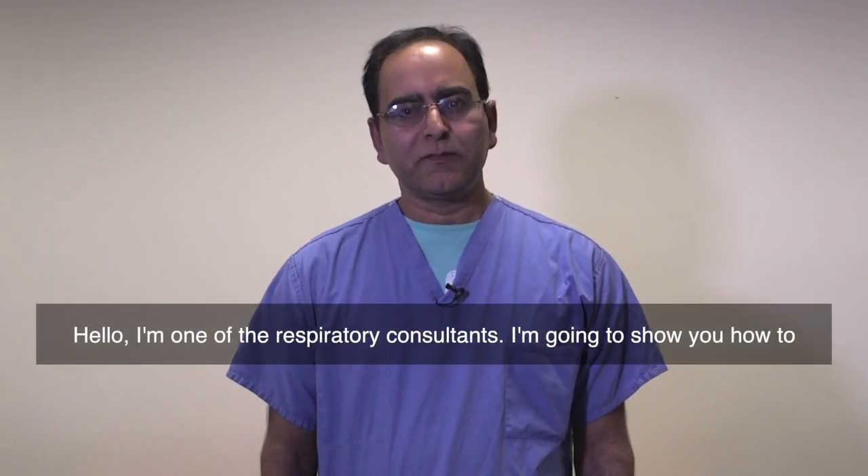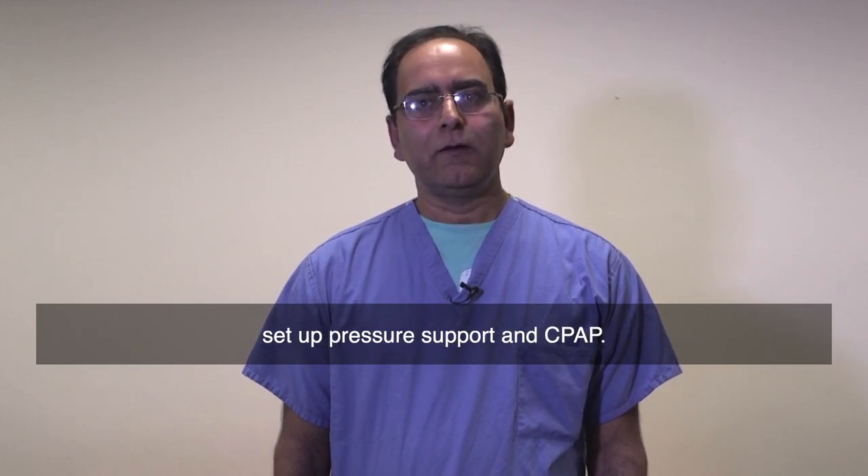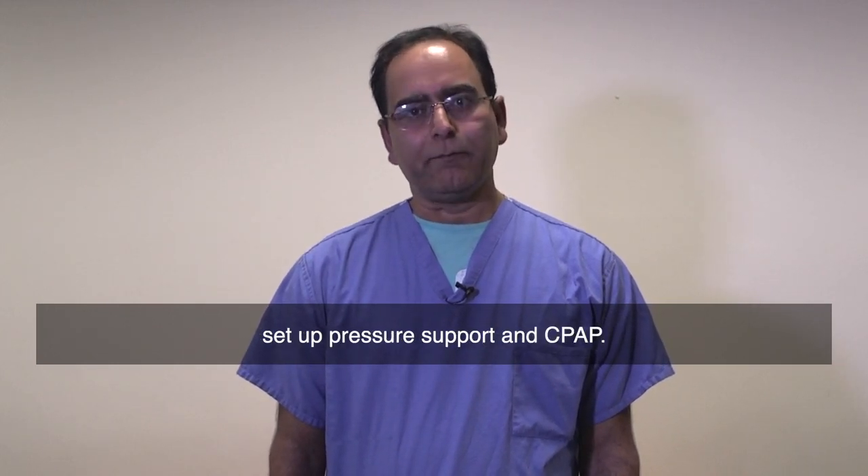Hello, I'm one of the respiratory consultants. I'm going to show you how to set up pressure support and CPAP.